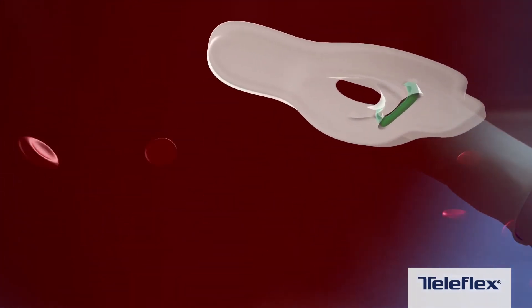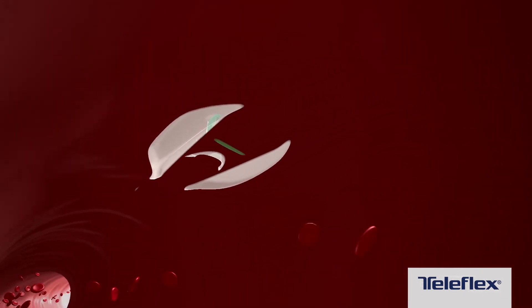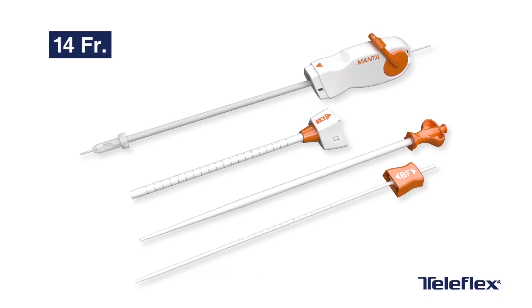The Manta anchor is low profile, non-thrombogenic, and resorbable. The radio-opaque lock remains and is fluoroscopically visible to guide future access 2.5 centimeters above or below the previous site. The Manta device is available in two sizes: 14 French and 18 French.